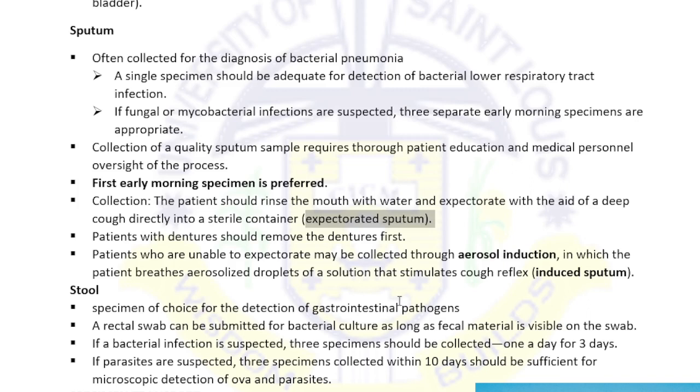However, in our country, we don't usually practice this one. Okay, giving aerosolized droplets. So, whatever the patient gives, that's it. Stool. Specimen for the detection of GIT pathogen.